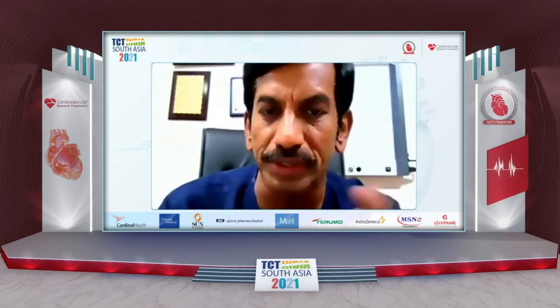stent over here. This is a long stent, you can see here, 2.5 by 33, but despite the tortuosities, with the pressure wire and the robotic drive, it went in straight, and at 14 atmospheres, we placed it there. And again, the precision part, the second point, every millimeter, you can advance the stent or withdraw here. There is a millimeter. So this is another part of the precision. Manually, it is a little bit difficult, especially as Medanta was showing that if you want exact 1 mm positioning, we can do that with the robotic precision. This is another big aspect of the robotic precision PCI.